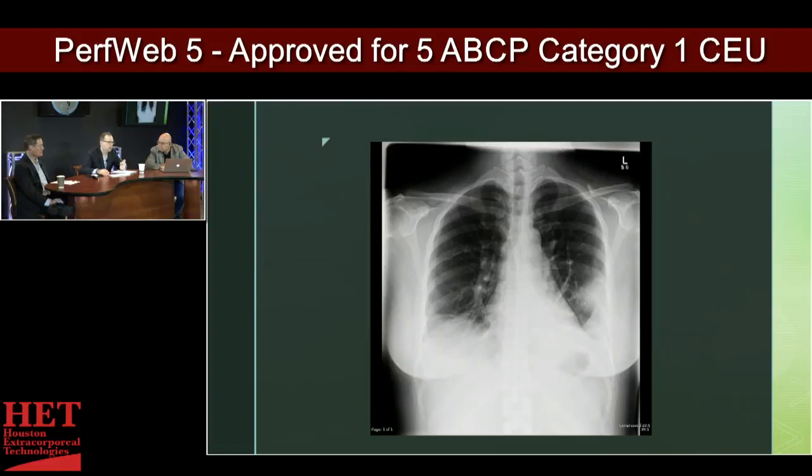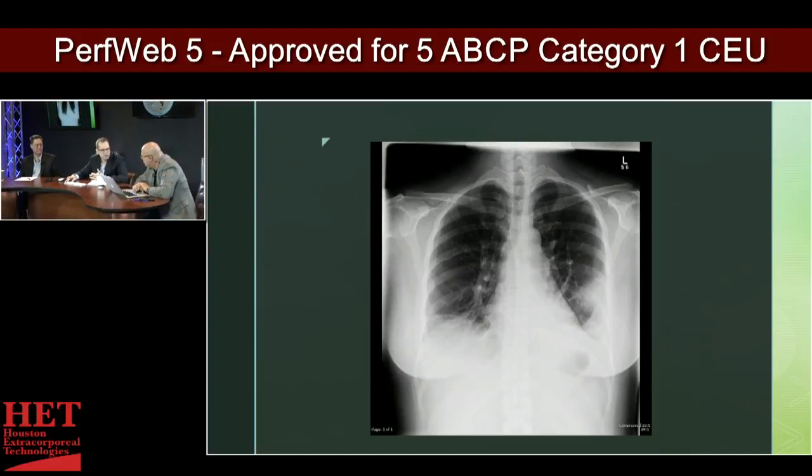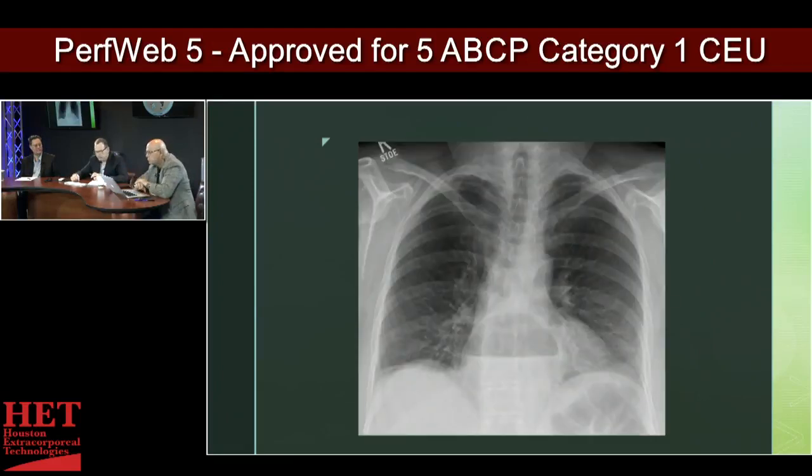Kind of one of my rules of thumb when I'm looking at patients that are resolving from ARDS, they've been on ECMO and they've shown continued improvement, maybe their ABGs are looking better, clinically they look good, but they still have a pretty ugly x-ray. Usually the x-ray will lag behind the clinical picture by several hours, if not a couple of days. And that works both directions. It does, absolutely.